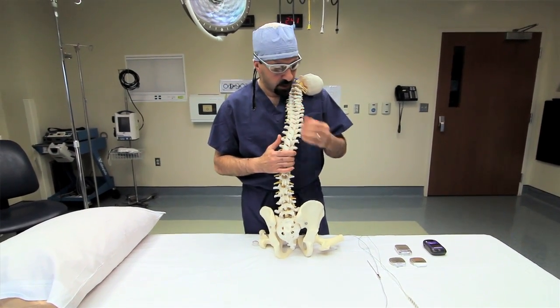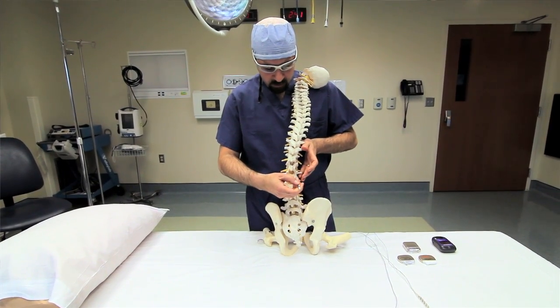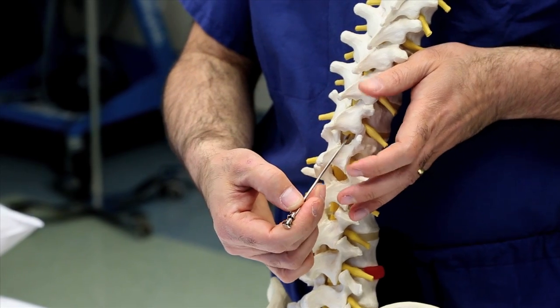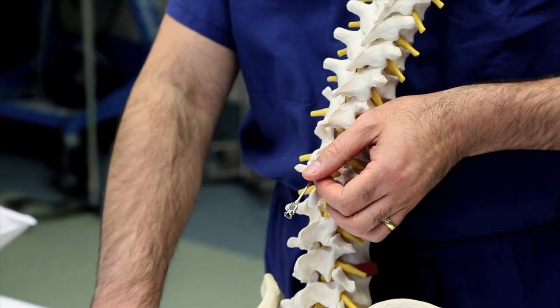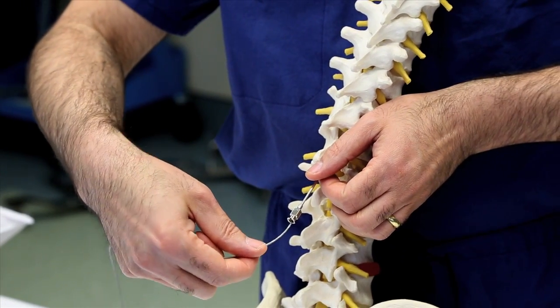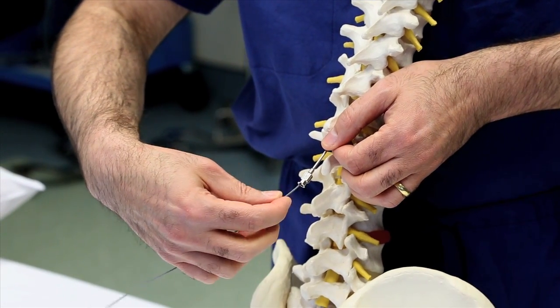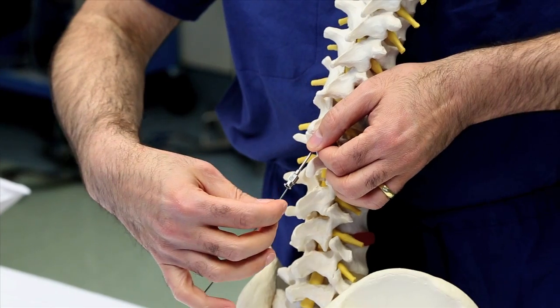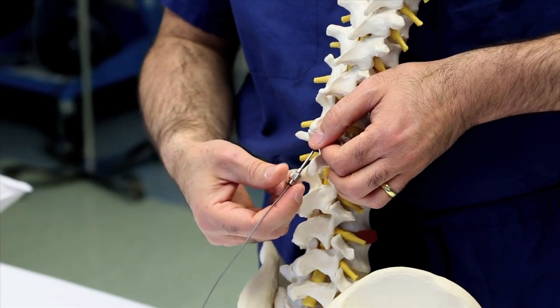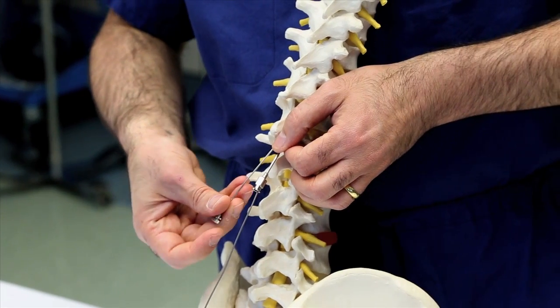Through this incision, again, the 2 needles will be introduced into the epidural space, and through the needle we again advance the percutaneous lead up to the posterior epidural space to the sweet spot, and the other needle will go from the other side.